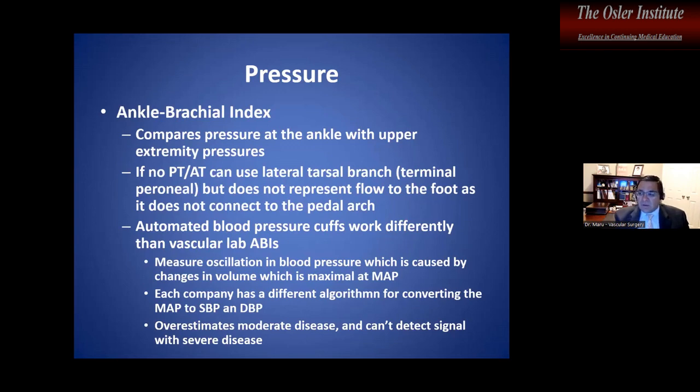Well, you've got to take a look at what they're doing, and realize they've used some automated cuff. It's just one spot check on their ABIs. We're talking about ABIs. They did one. They've got an ABI of 0.4. Doc, I've got to get this fixed. Yeah, they did one spot check, one cuff. It was an automated system. They have no idea what they're talking about, right? And then 9 times out of 10, they're going to come in and you actually feel a palpable pulse. And you're like, all right, this doesn't match up.